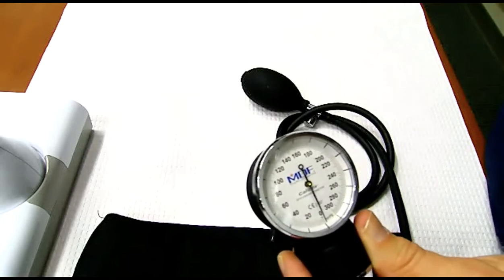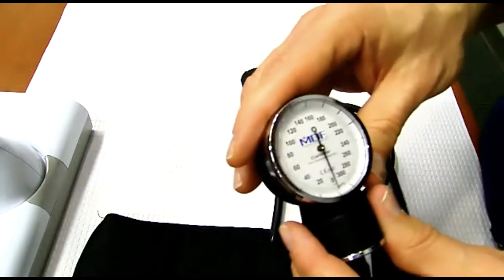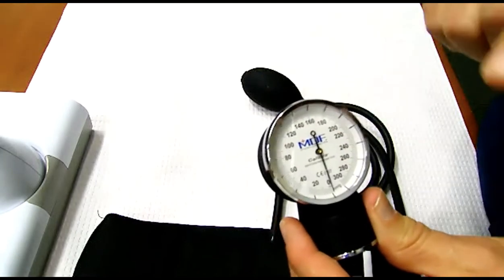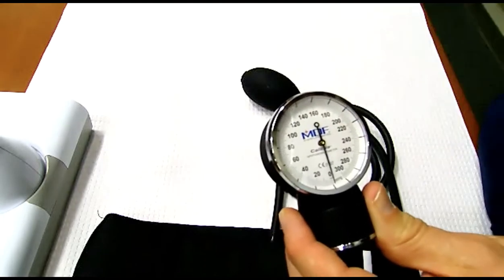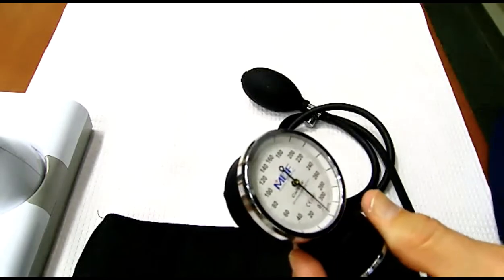Can you estimate halfway between two notches? Sure, you can. I'm not sure that you really need to be that accurate, but make sure you realize that whatever notch you're looking at, you can interpret its value. Every little notch is 2 millimeters of mercury from the number below it. Okay, so anyway, I'm not sure I did a good job explaining that, but hopefully you can understand how to read it.